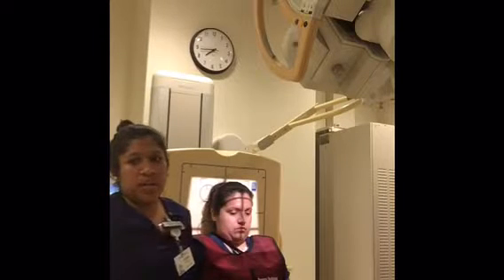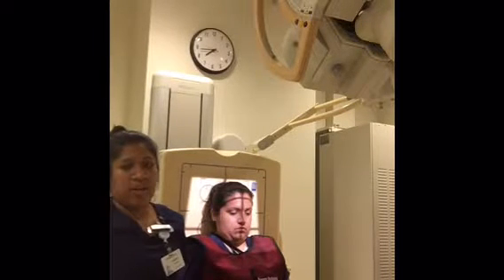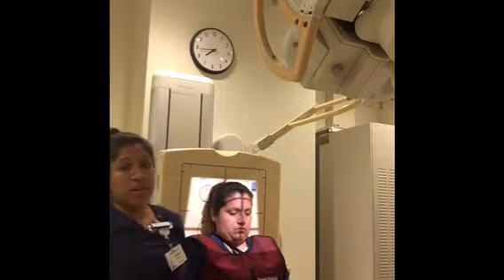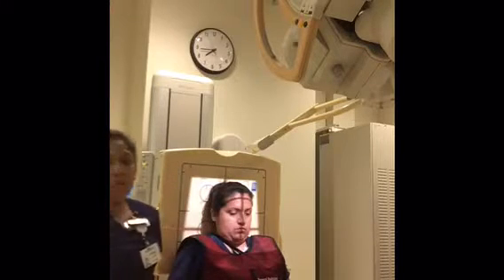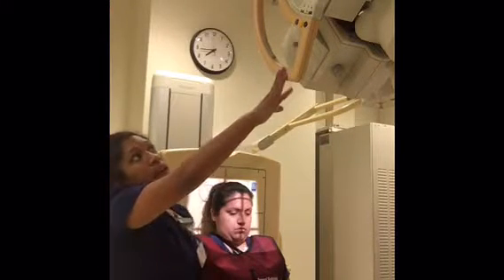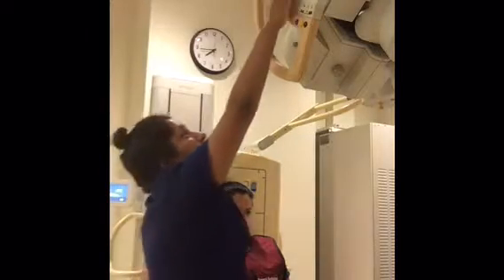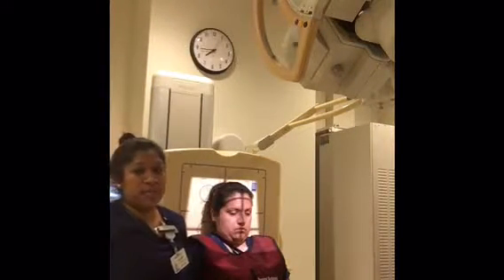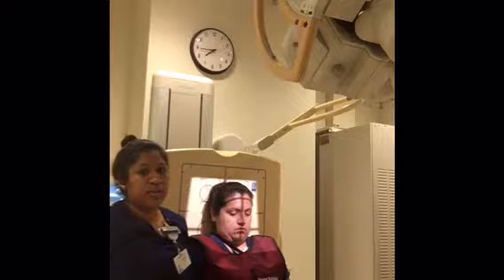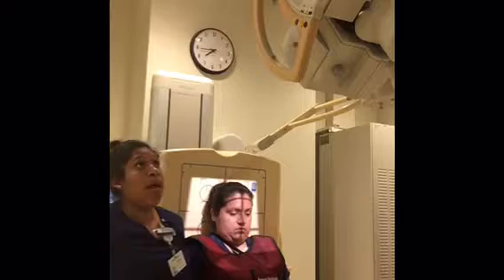Okay, so now we're going to shoot our AP axial projection, Towns method. So we have our cassette. It is a 10x12 and it's lengthwise. So we have it right here, 10x12 lengthwise. We have our SID 40 inches. That is detented. And then our central ray enters 2.5 inches above the glabella, and it passes through the level of the EAM directed through the foramen magnum at a caudal angle of 30 degrees to the OML.